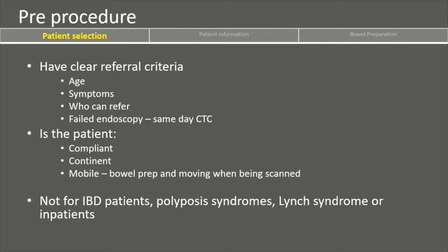It's quite common for junior doctors to inappropriately request CTC when they don't really understand what the test involves. So having clear guidelines of who can actually request CTC is really important. Do you offer a same-day CTC service for failed endoscopy?